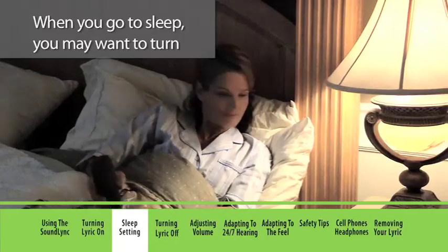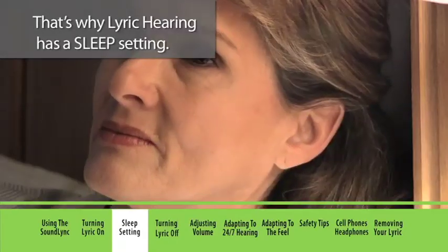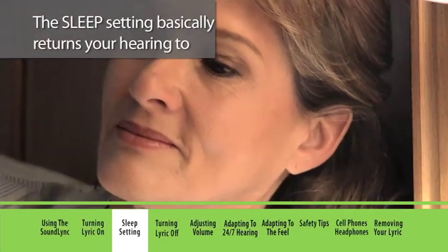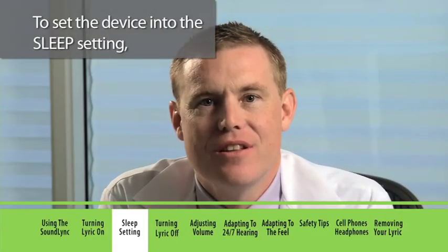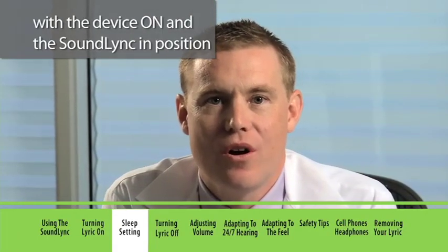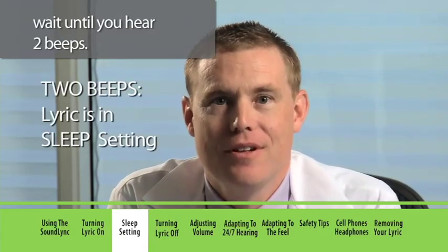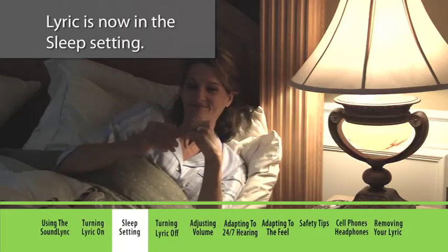When you go to sleep, you may want to turn down the volume or put Lyric to sleep. That's why Lyric hearing has a sleep setting. The sleep setting basically returns your hearing to where it was without Lyric. To set the device into the sleep setting, with the device on and the SoundLink in position, wait until you hear two beeps, then immediately remove the SoundLink from the ear. Lyric is now in the sleep setting.